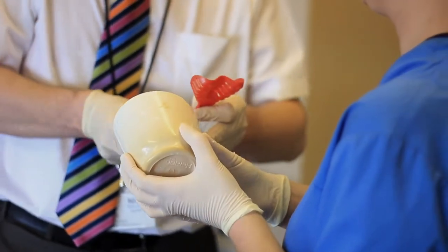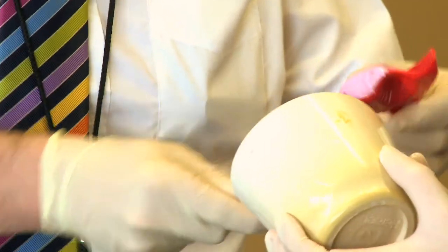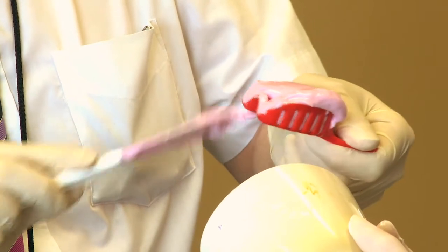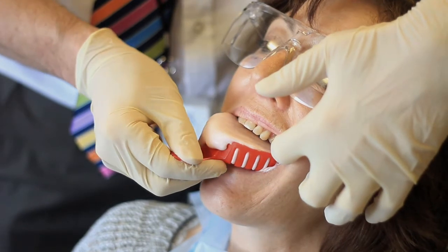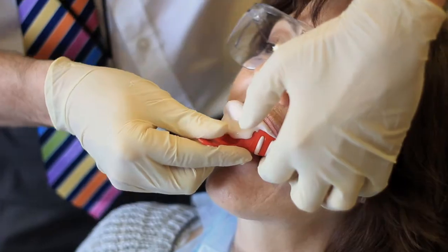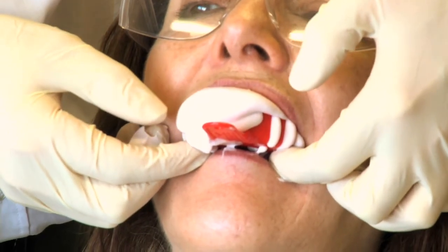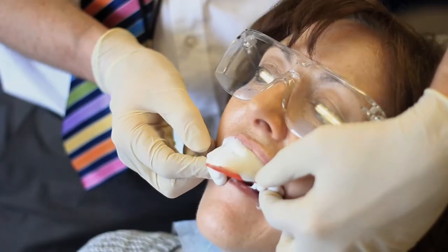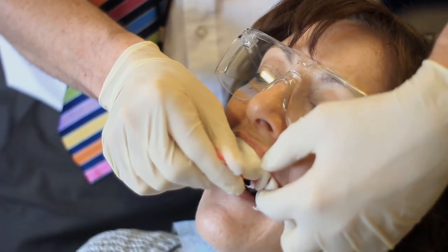That's great. I'll just put that into the impression tray once again. That's perfect. Just going to stretch your cheeks out the way and just put this into your mouth now. Okay, and it'll just take a couple of minutes to set. Just take that out now, okay, so just like we did before.